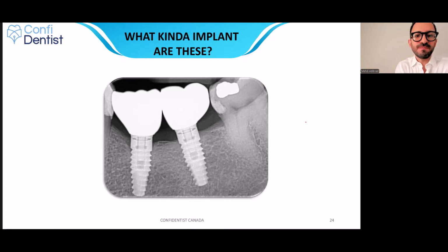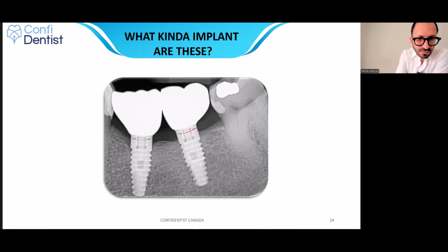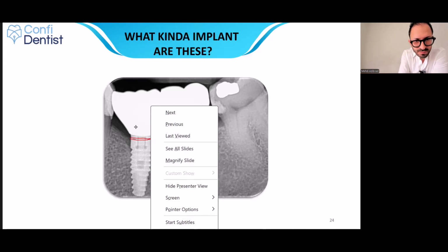Yes, this is a bone level implant. This is my prosthetic platform. These are the steps that you guys should go. First, identify the prosthetic platform. This is my prosthetic platform.